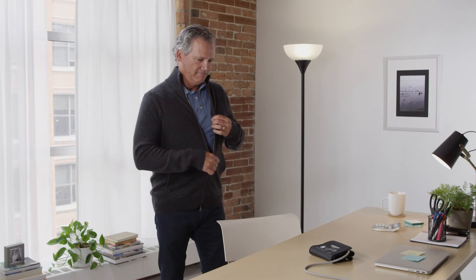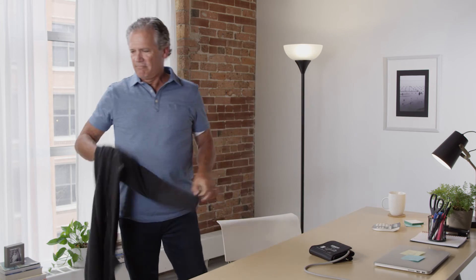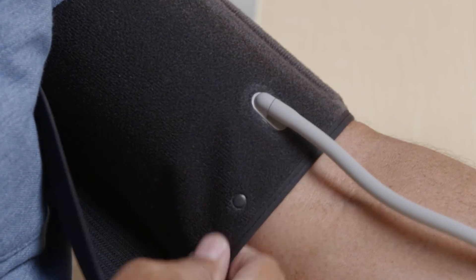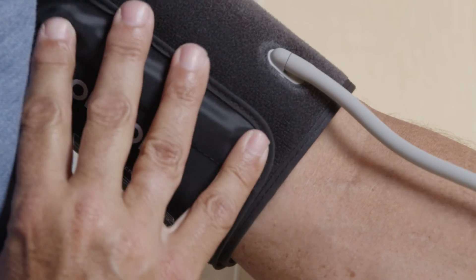To use the soft D-ring cuff, first remove any bulky clothing on the arm you are measuring. Wrap it firmly in place on the upper arm. The bottom edge of the arm cuff should be half an inch above the elbow.